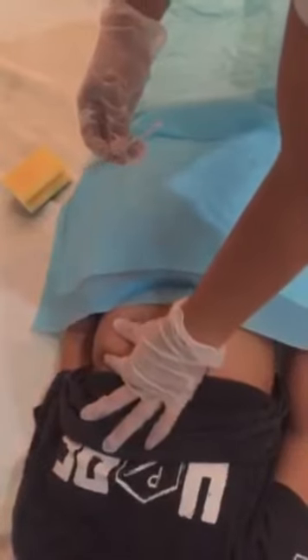Clean the site with an antiseptic swab. Start at the center of the site and clean in a widening circle to about 5 cm, 2 inches. Allow the area to dry thoroughly. The mechanical action of swabbing removes skin secretions, which contain microorganisms. Using this technique keeps the cleaned area readily accessible when the needle is withdrawn. Prepare the syringe for injection.